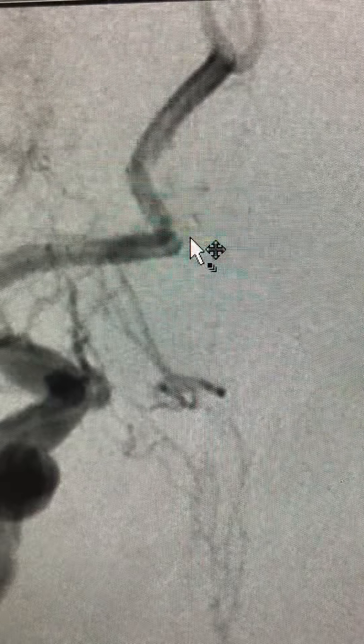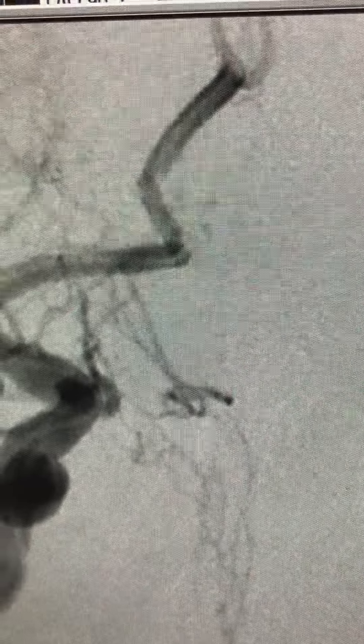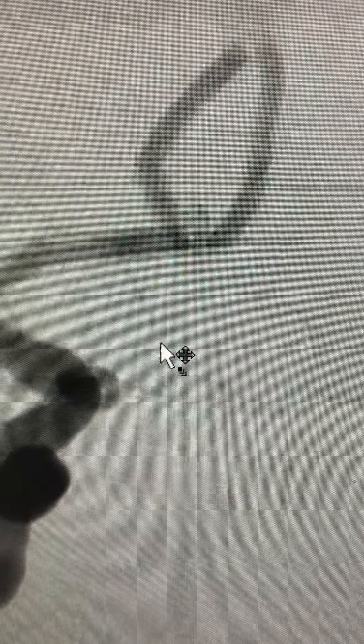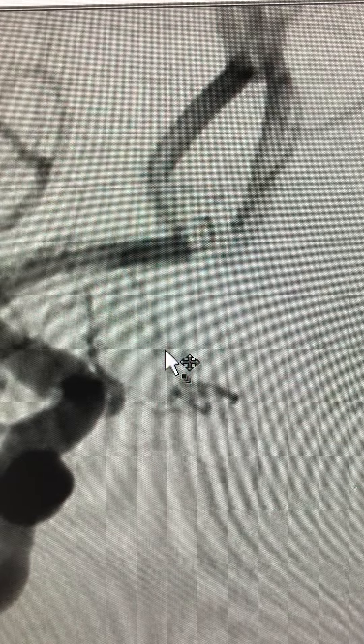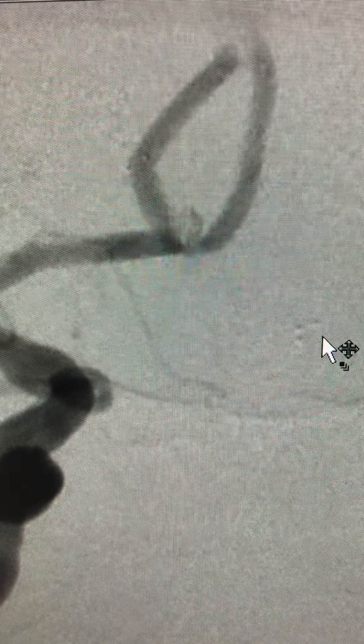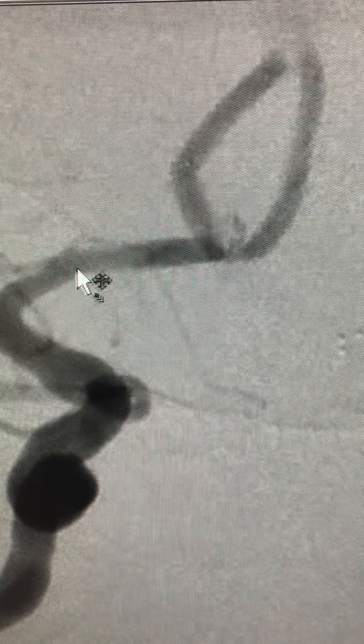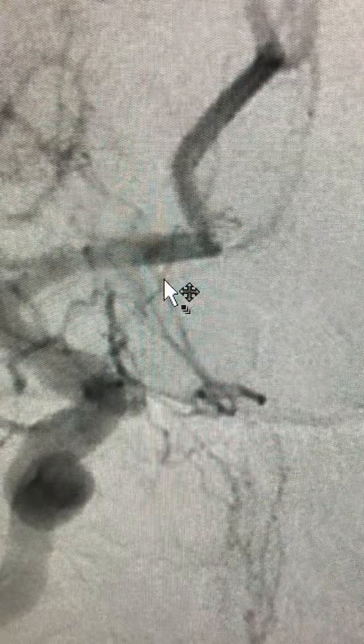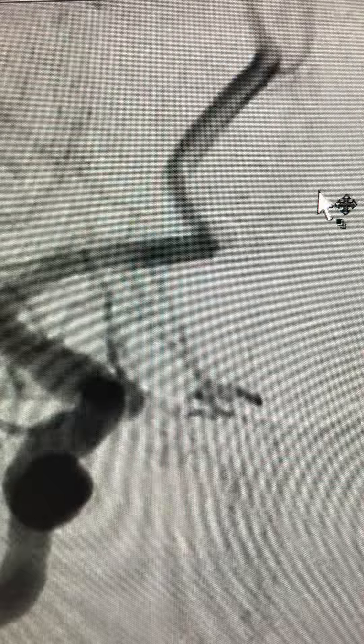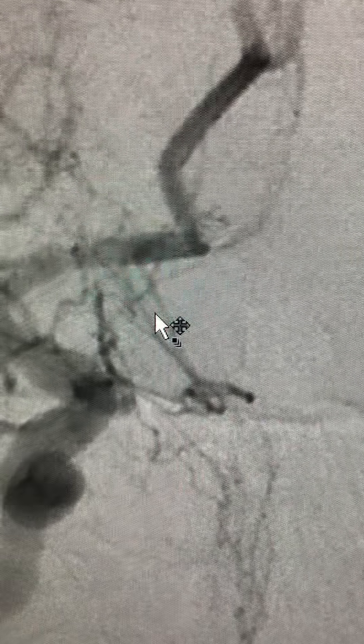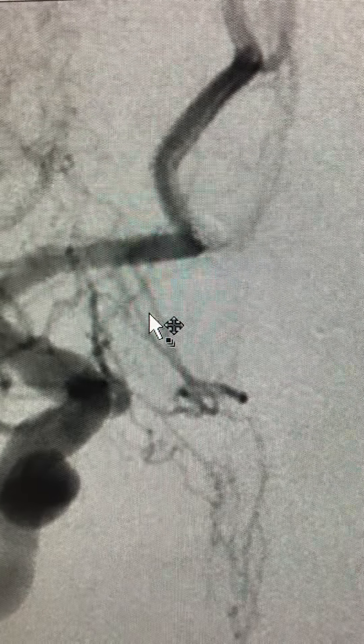I came from the right side to the left side to place the second stent, then placed the coils in the sac of the aneurysm. The coils used were just 1.5 mm 3D coils and I placed two of them. These are the two stents: one coming from left A1 to right A2, and the second stent coming from right A1 to left A2, completing the X-stent configuration with coiling.